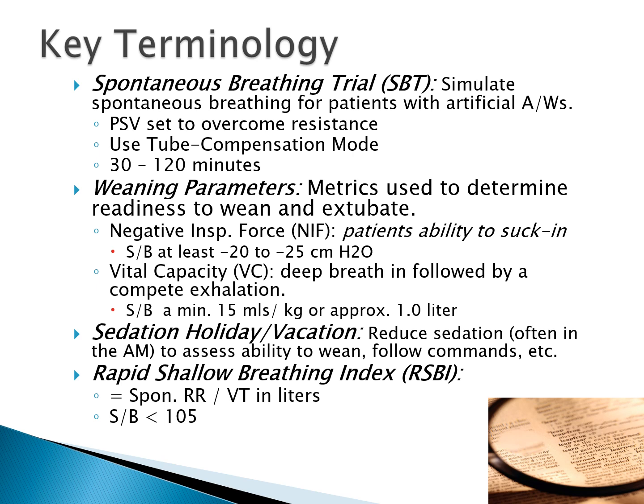They're pulling these really robust tidal volumes of, let's say, 800, 900, 1,000, but they're only breathing at 6 breaths per minute because they're not fully awake. So their RSBIs will be in the teens, extraordinarily low. They may, in an hour or 2 or 3, be very ready to be weaned and extubated, but they're not quite ready right yet. So we're typically looking for an RSBI between like 20 to 25 and about 100 to 105, something along those lines.